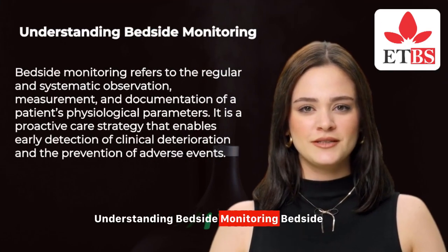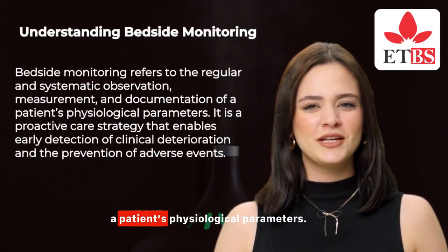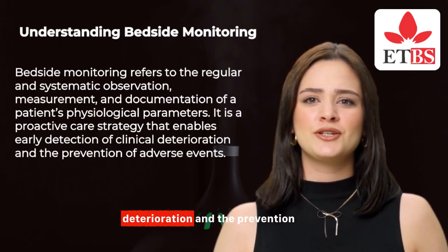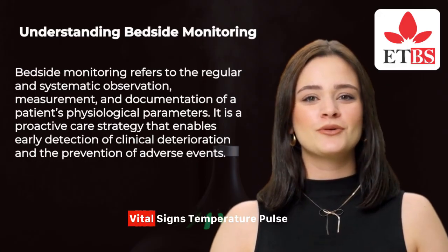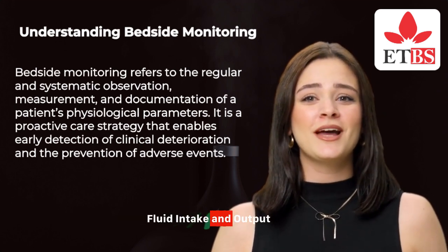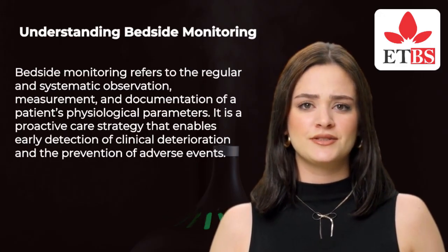Understanding bedside monitoring. Bedside monitoring refers to the regular and systematic observation, measurement, and documentation of a patient's physiological parameters. It is a proactive care strategy that enables early detection of clinical deterioration and the prevention of adverse events. Core parameters to monitor: vital signs, temperature, pulse, heart rate, respiratory rate, blood pressure, oxygen saturation, fluid intake and output, consciousness and mental status, pain assessment, skin integrity and color, mobility and safety status.